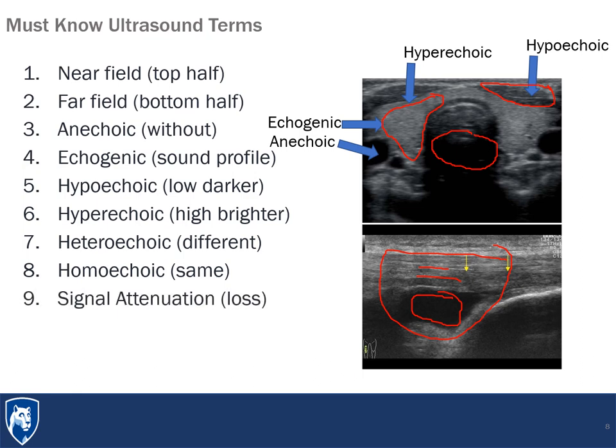Other things that are happening with sound is attenuation, which is always happening. Even if you step further away from the speakers that you're listening to this with, you would have an attenuation of the sound as you get further away. The ambulance that EMS drives to a scene in has an attenuation as it drives away from you.